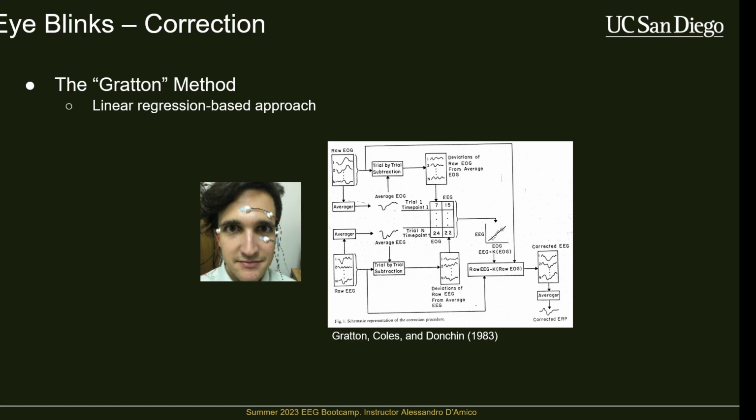I think people have also trained ICA on their training data and then used that unmixing model in real time to remove blinks. In synchronous BCIs, it's not like you're having to do this continuously in real time. You get your epoch, you process it, and you usually have at least a couple hundred milliseconds to remove that, remix the component, and then do some analysis on it.